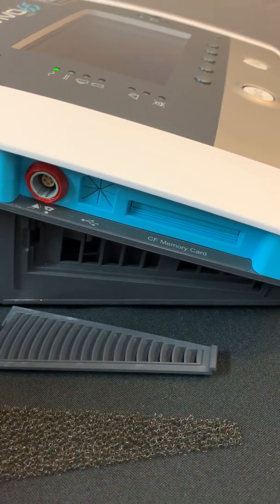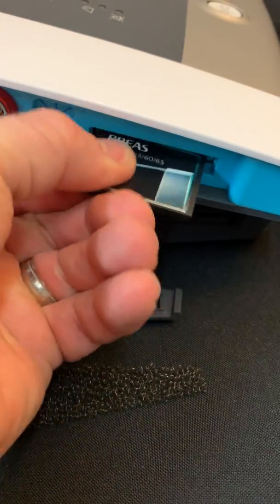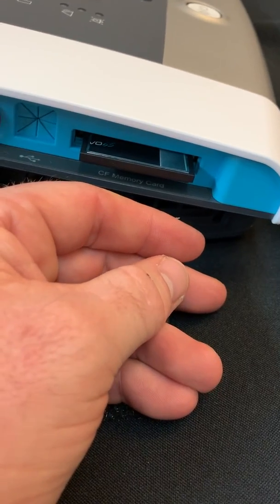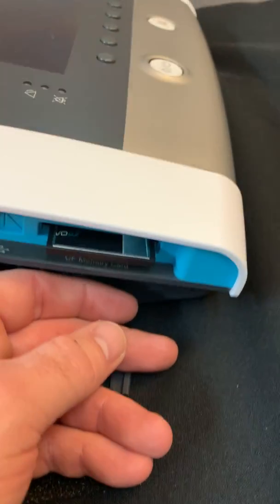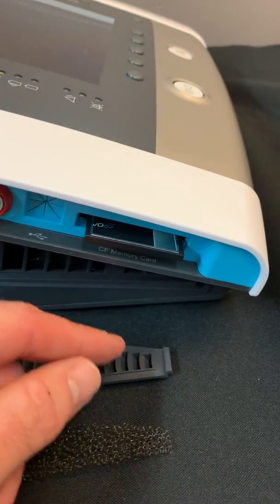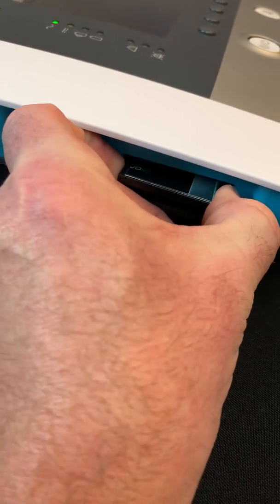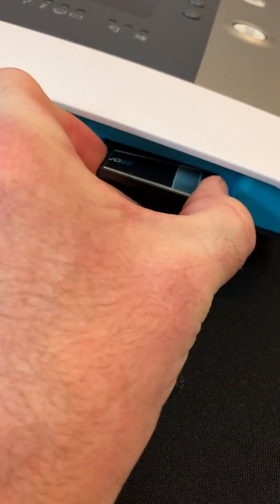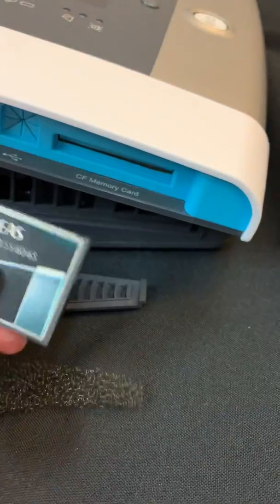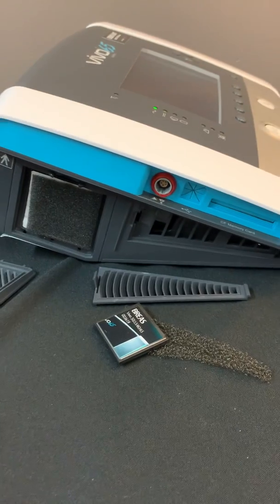The compact flash card looks something like this, and the card simply slides into the machine — that's about as far as it goes — and then you're able to download information onto the compact flash card. That information can then be generated into a report form or analyzed using the BRAIOS PC software. And that is basically the left panel of the device.